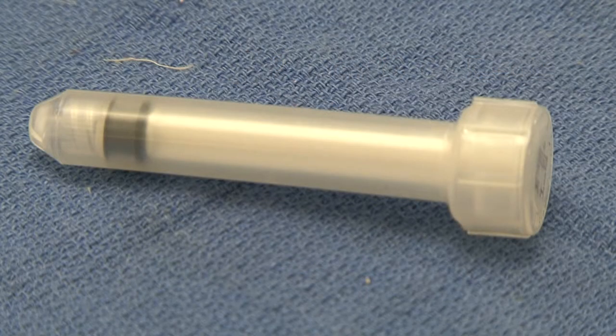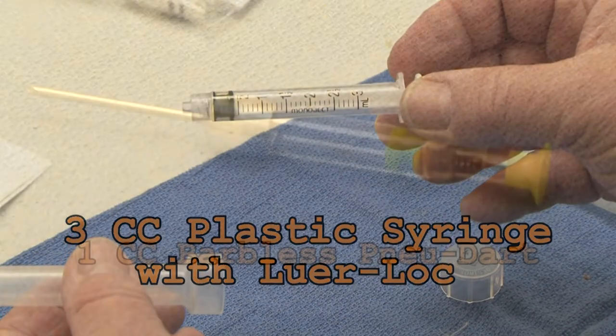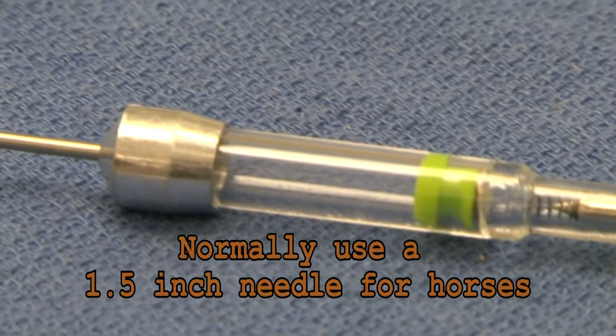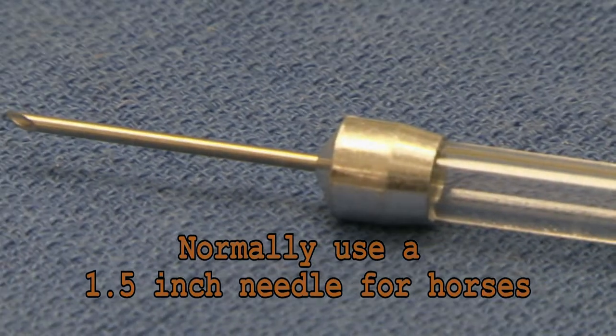Depending on whether you are going to deliver the vaccine by hand injection or by dart, you will also need a 3cc plastic syringe with Luer-Lok, or a 1cc barbless Pneu-Dart. The needle length on the Pneu-Dart will depend on what species you intend to treat. Normally, we use a 1.5 inch needle for horses.